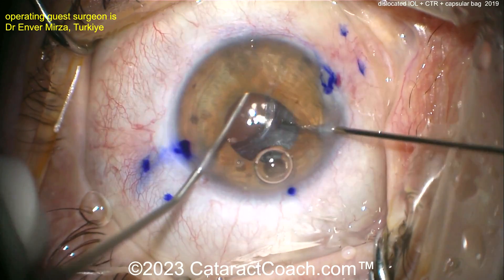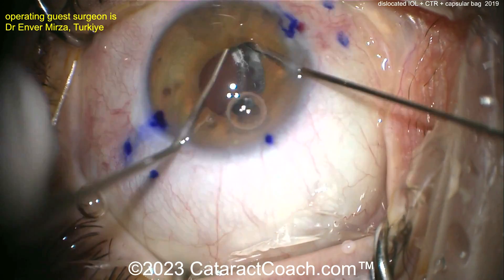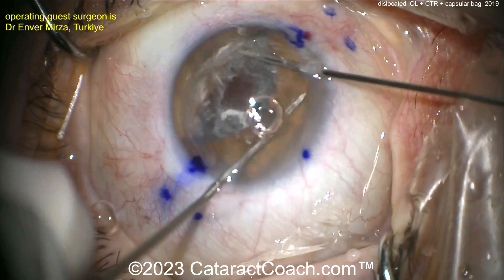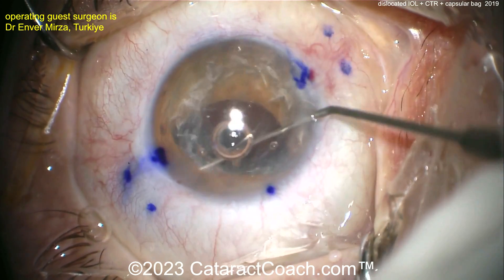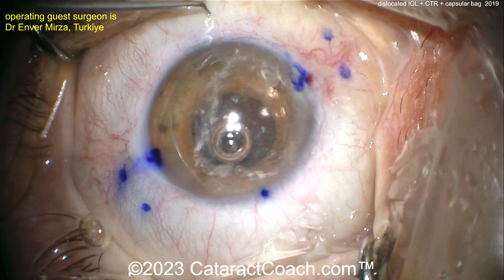Going underneath the lens and grabbing it — you want to bring it up into the anterior chamber. Remember, with the CTR it's going to be large. Here it comes, like delivering a baby: there's the whole capsular bag plus CTR plus IOL complex. That's all brought up through the pupil into the anterior chamber — you can see the CTR as well.